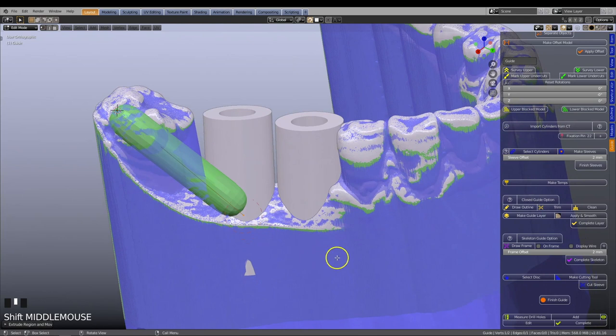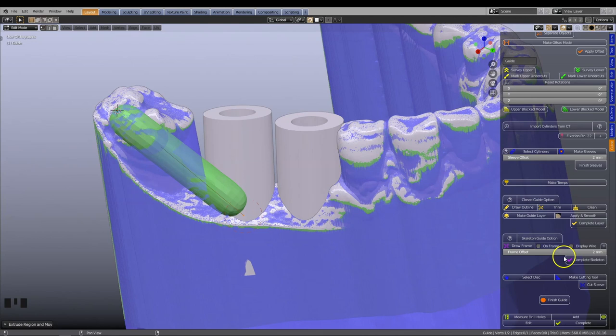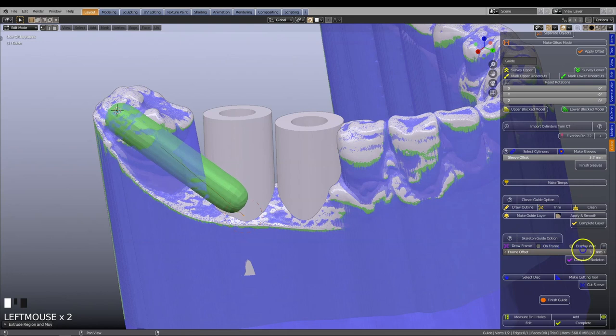This value is displayed in the slider bar on the menu over here. You can change the frame offset value anytime. For this demonstration, we will keep the value set to 2 mm.